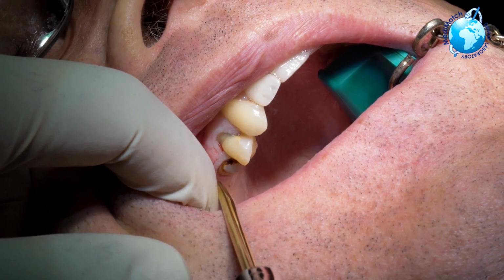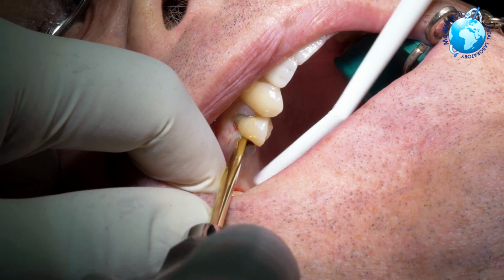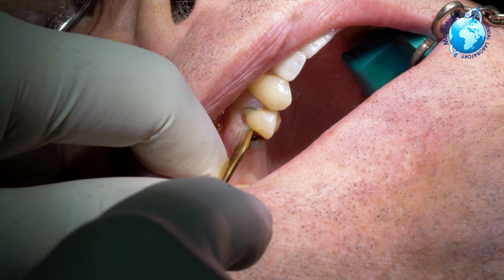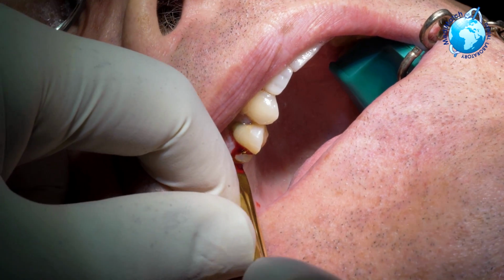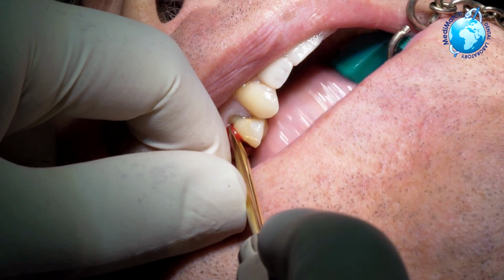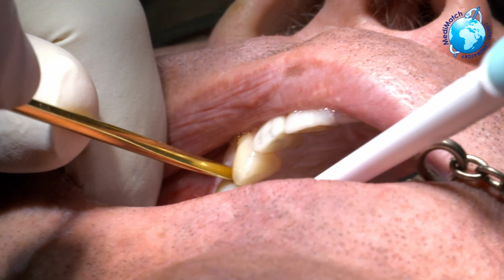So I'm going to start by extracting the roots by just slowly breaking the periodontal ligaments between the tooth and bone, with gentle pressure on the actual root faces themselves. They're quite loose anyway, so just gentle pressure, creeping around with the luxator there. My nurse just aspirates so I can see what I'm doing. Yeah, that's the one. And we're just going to put some more pressure here.